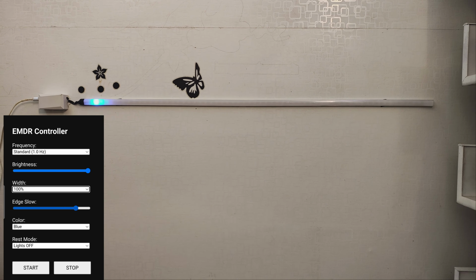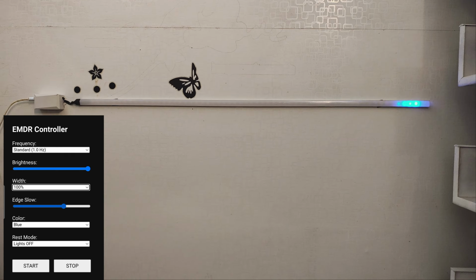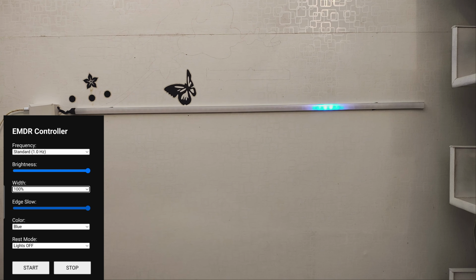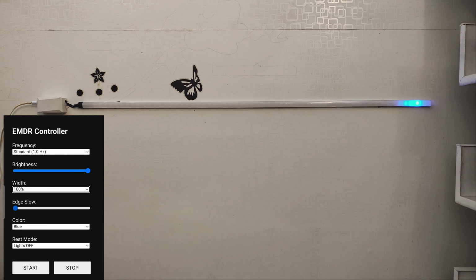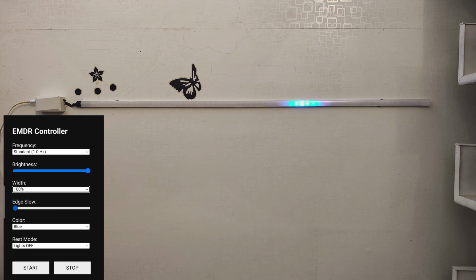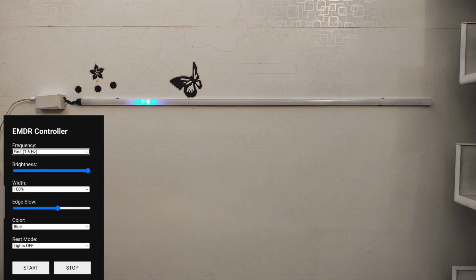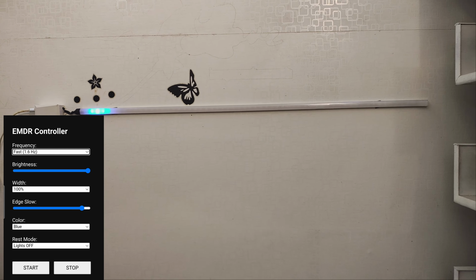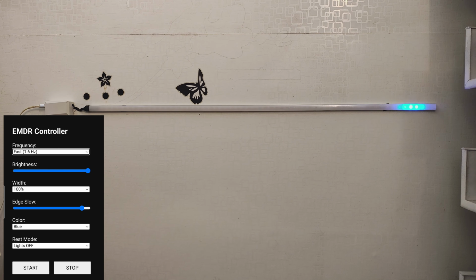Now I can change how much the light slows down at the edges. This helps clients follow the light precisely without much eye discomfort. Actually, the light follows a sine or an arc sine wave depending upon the edge slowness. It can be adjusted to the client's level of comfort. In very fast processing frequencies, edge slowness can be a make or break for a session. It is very useful.